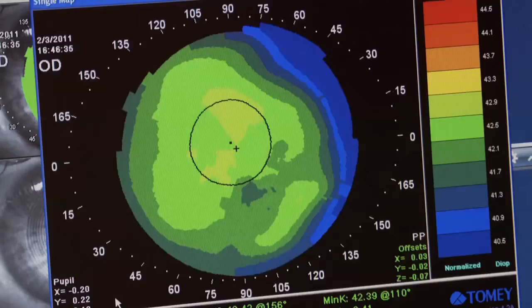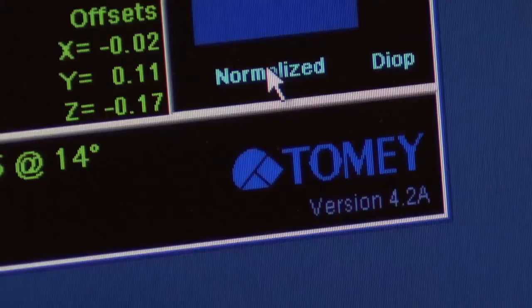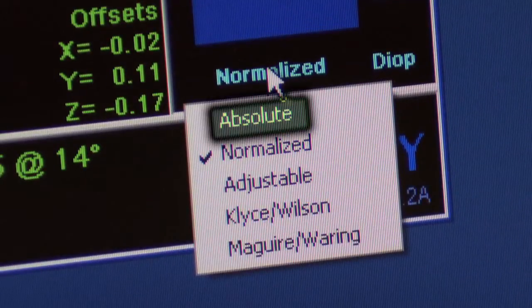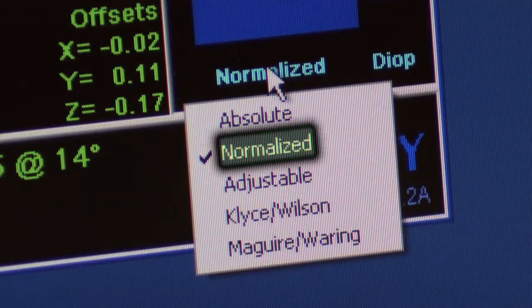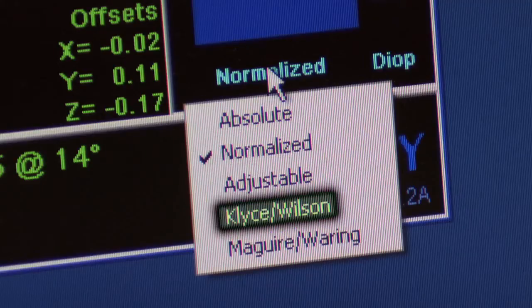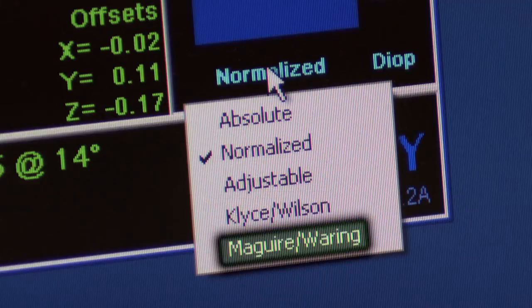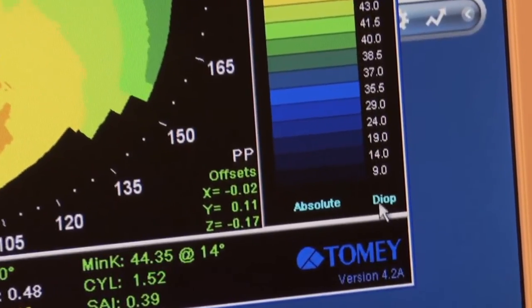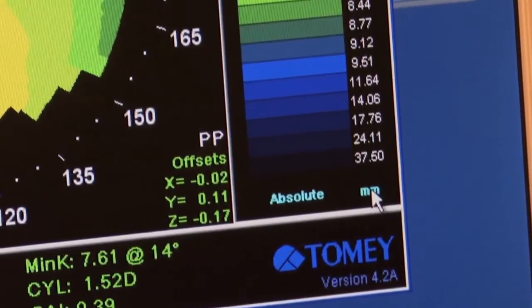The single map displaying the topographic map will appear. The single map can be viewed in the Absolute, Normalized, Adjustable, Kleiss-Wilson, and McGuire-Wearing modes. The scale on the right can be viewed in the Diopter or Millimeter mode.